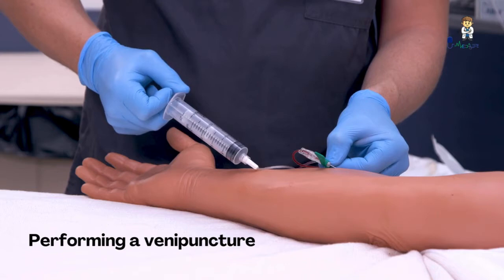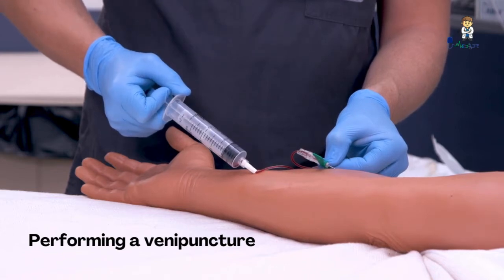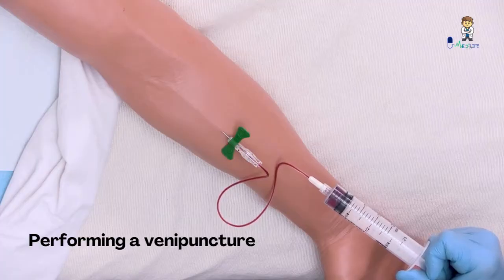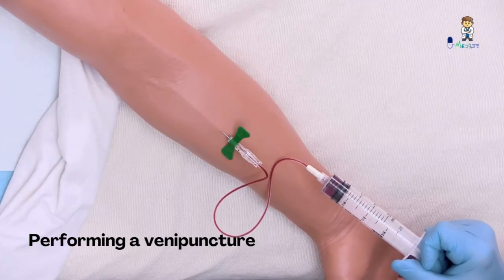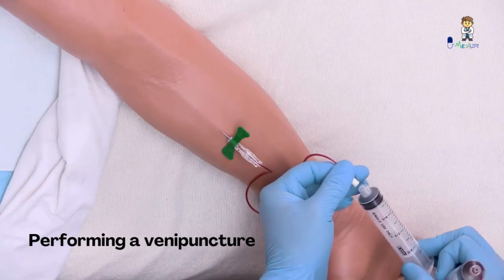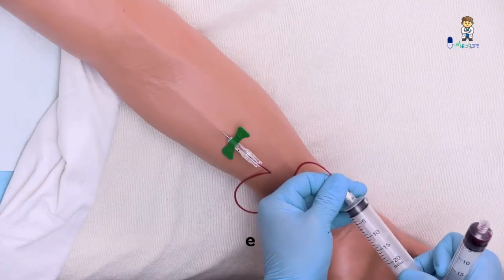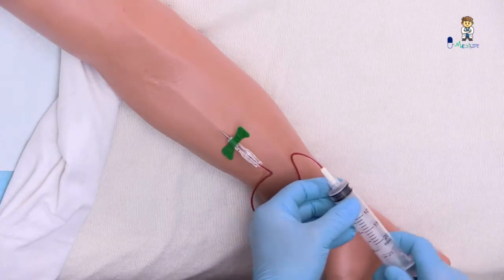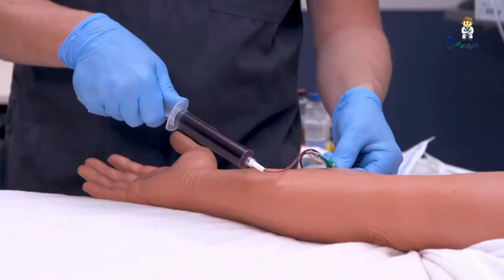Perform venipuncture using a straight or winged needle and discard the initial volume of 1 to 5 milliliters of the blood sample if directed by your facility, to prevent introduction of contaminant organisms contained on the skin.